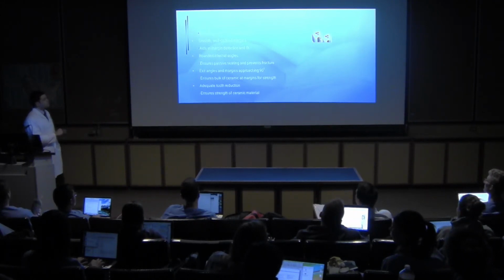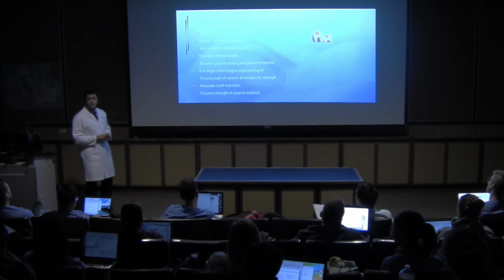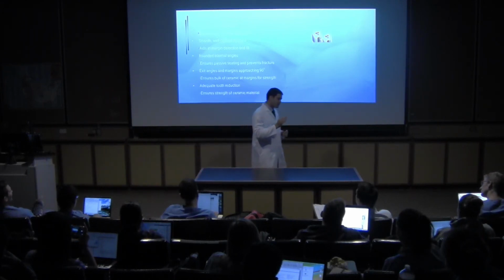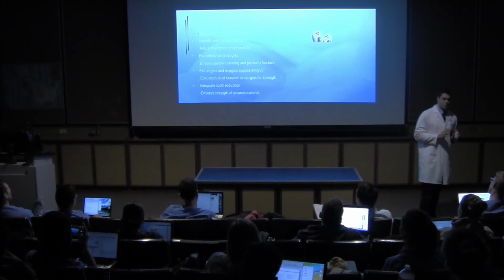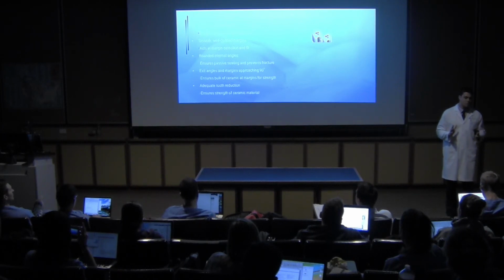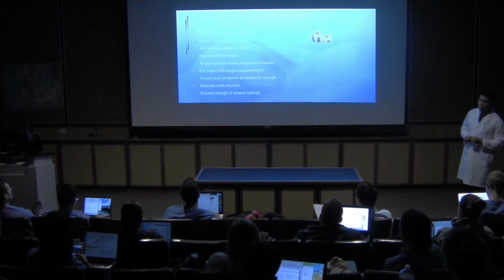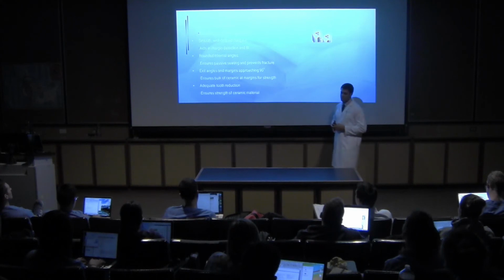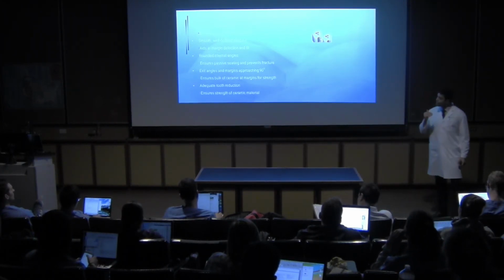Smooth tapered walls will ensure us good internal adaptation. Preparation in inlays, onlays, and overlays: tapered walls, always. Not undercut walls. Smooth, well-defined margins will aid us in margin detection and fit. Okay, we need to have a very good defined margin.